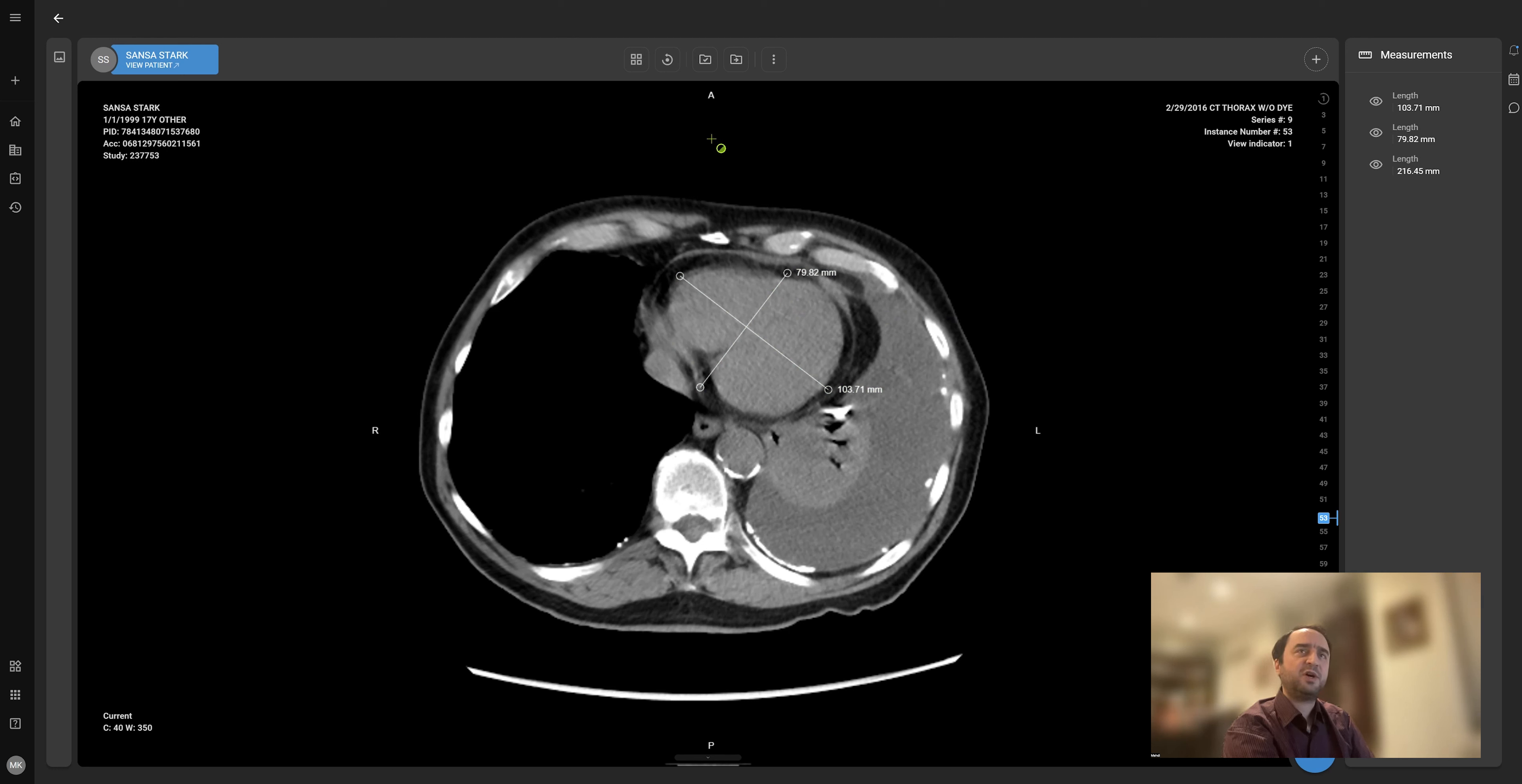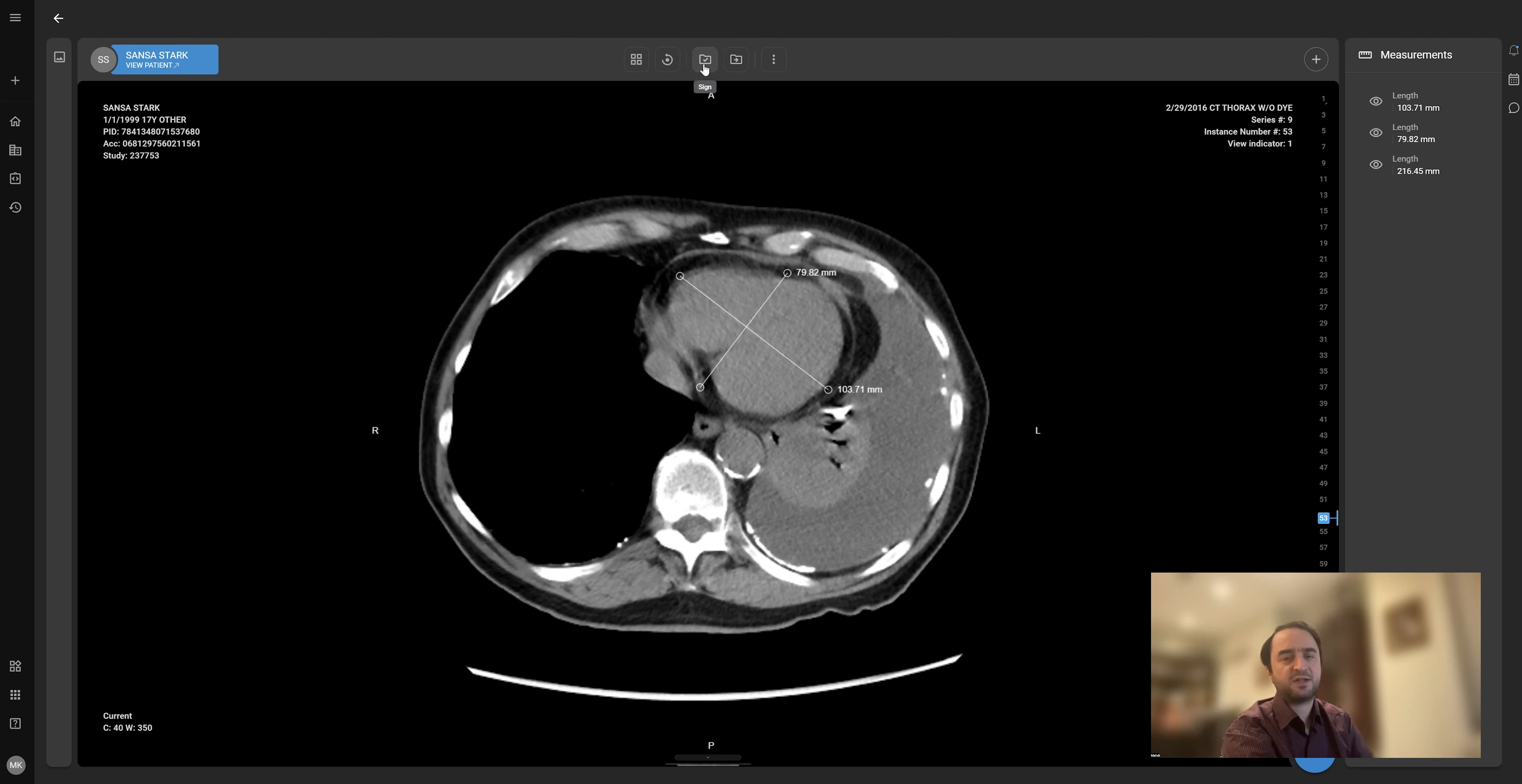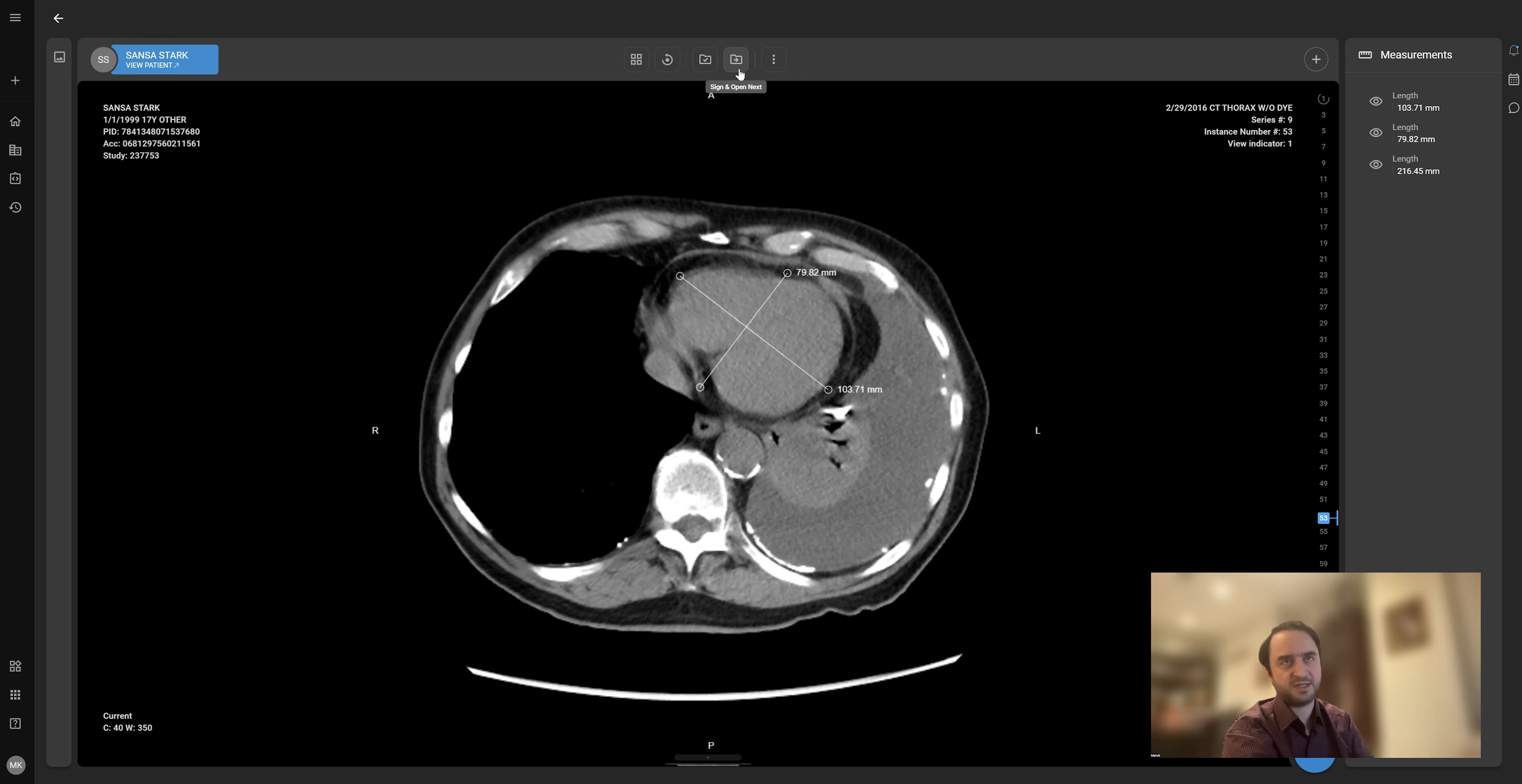The other thing which was received well was the sign and go to next study feature. Usually you have two options: one is to just sign a study and go back to the worklist; the other is to sign a study and the system opens the next study for you. When I click this option, this is what's going to happen.